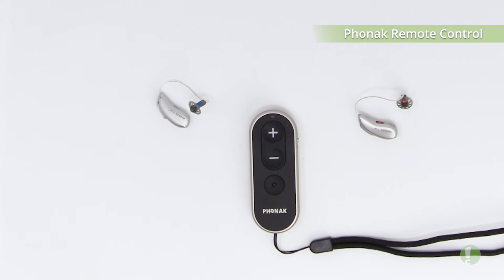Very simple to use. It helps you to discreetly make any minor changes so that you can utilize your Marvel hearing aids with more efficiency and be able to hear better in all situations.